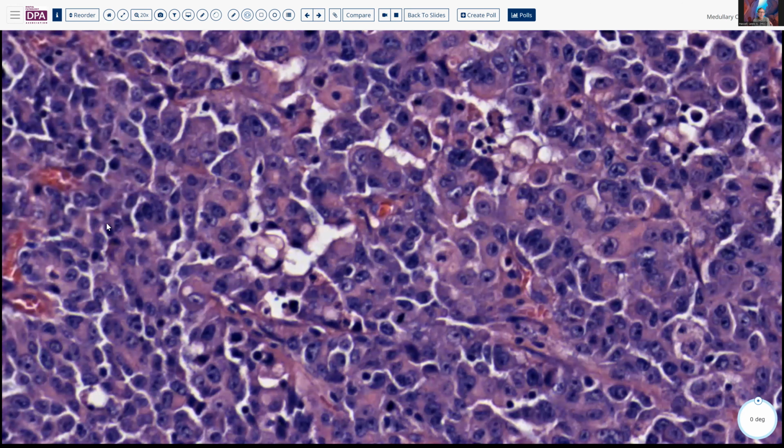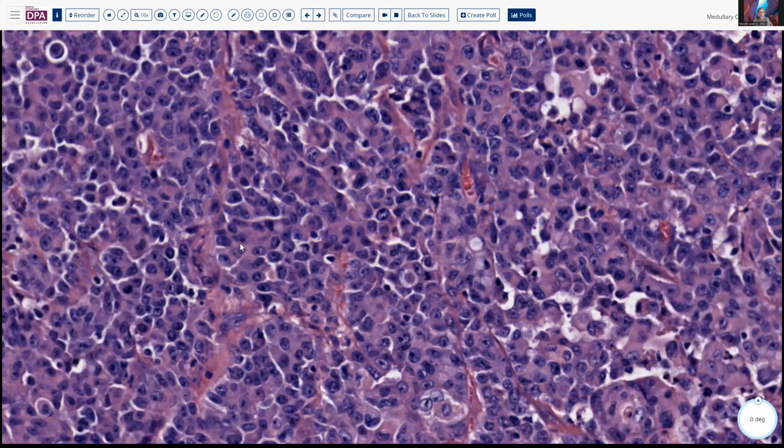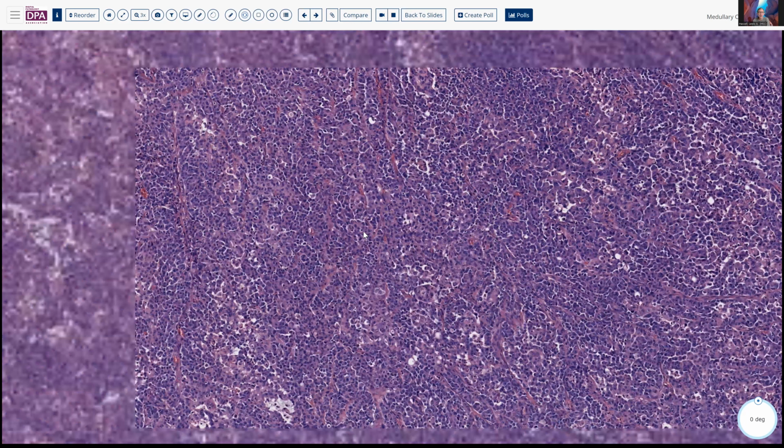Looking around, though, I mentioned the inflammatory cells, and we'll see, actually, if you were to stain, that there are a fair number of smaller inflammatory cells admixed with this, so-called tumor-infiltrating lymphocytes. And as we have learned in other sites, that's oftentimes a marker for mismatch repair defects, which we'll discuss here in just a minute.